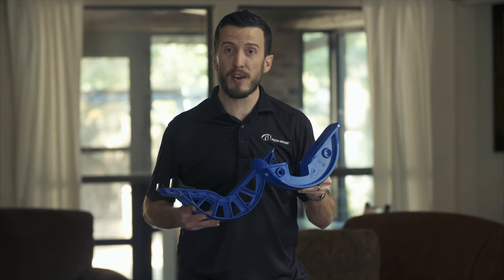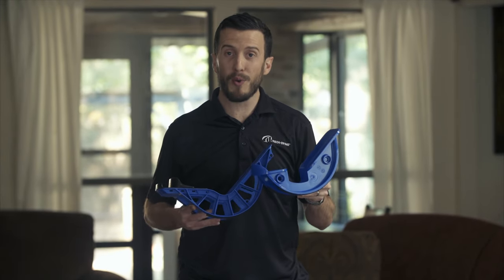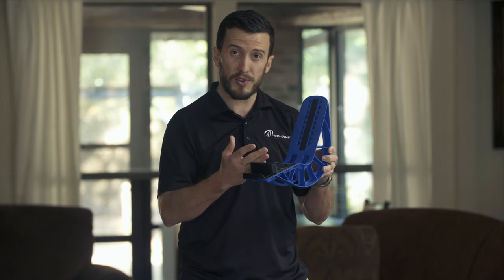The original Pro Stretch has been around for over 20 years, used by medical professionals all over the world as a one-size-fits-all lower leg stretching product. The Pro Stretch Plus is a newer model — it actually has a wider platform and accommodates a larger shoe size.